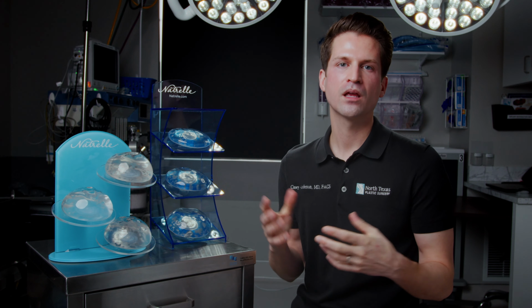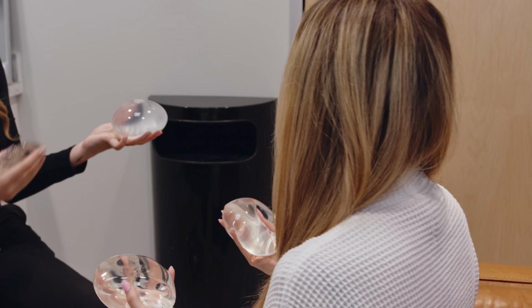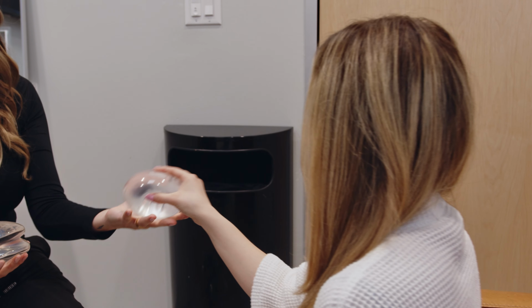So if you come in and you say, I'm a little deflated after pregnancy and I just want to be back to where I was before, and that was a full C, and now I'm like a deflated B, she'll pick a sizer that kind of is guiding us to where we want to go, and then you'll slip that in the sports bra and you can see in the mirror, okay, that's kind of looking like I want, or it's too big, it's too small. And y'all can play around from there with the different sizers to get to the look that you're hoping to achieve. And then we can see what number is on that sizer to help guide us further.